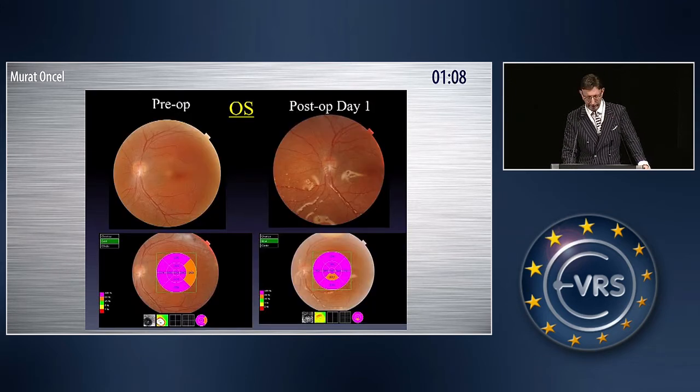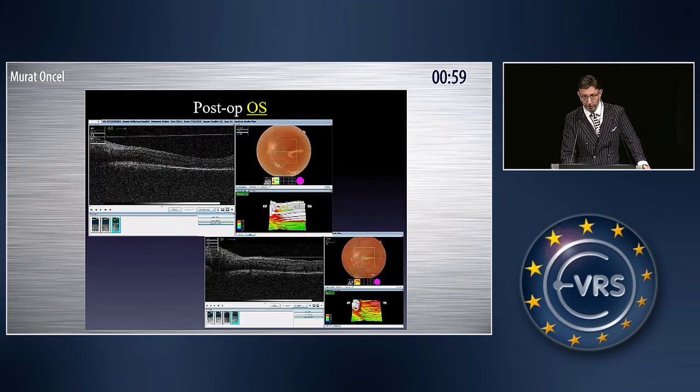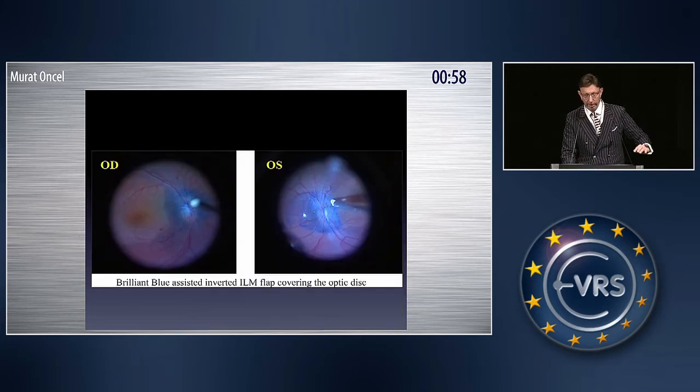Here is the same patient's left eye, operated four days later. Again, at post-op day one, the macula is totally flat and the subretinal fluid is absorbed. Here you see the ILM flap covering the optic disc pit.